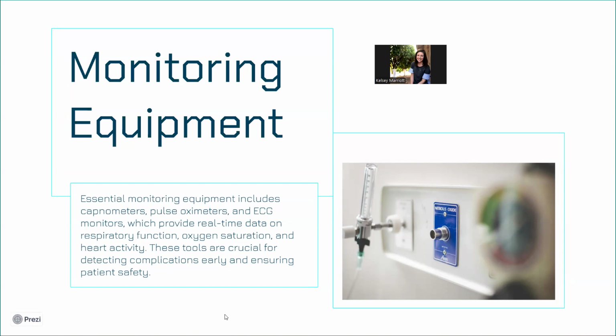We never used a blood pressure machine. All we did was SpO2 and a manual heart rate and respiratory rate. That's not ideal medicine in the sense of gold standard. It gets by, but to give us the best standard possible, we want to go all out with our monitoring devices to be able to interpret where our patient is at anesthetically.